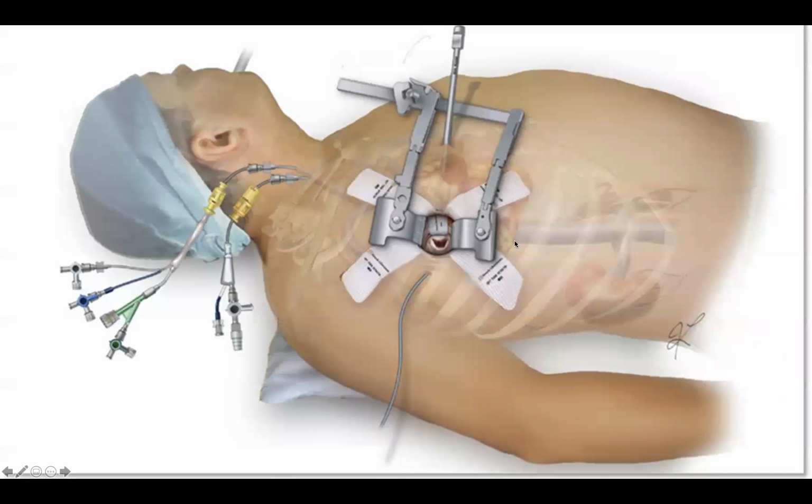And this wouldn't be doable or feasible if we weren't able to cannulate the patient and put them on cardiopulmonary bypass using alternate techniques. Typical techniques of putting them on bypass include cannulation through the groin. Usually the femoral artery and femoral venous cannulas are put through the groin. And then we also put a separate right neckline up in the right internal jugular. All of this is thanks to the abilities of our anesthesiologists, who are able to do this fairly easily in conjunction with the help from our nurses and anesthesia technologists.